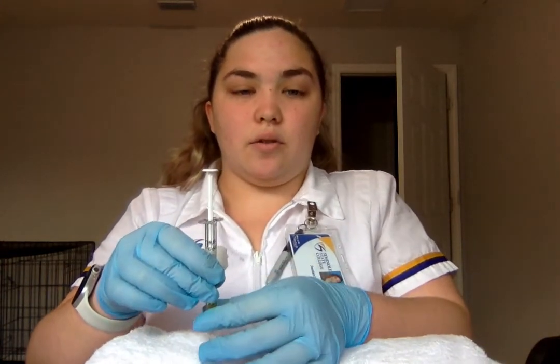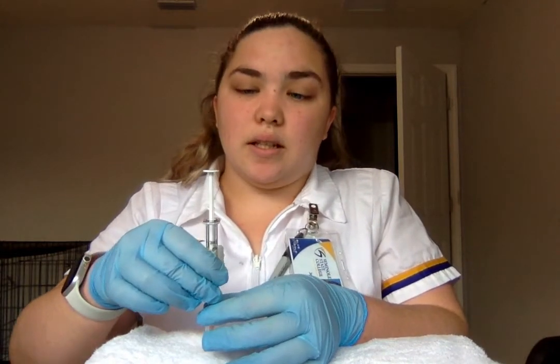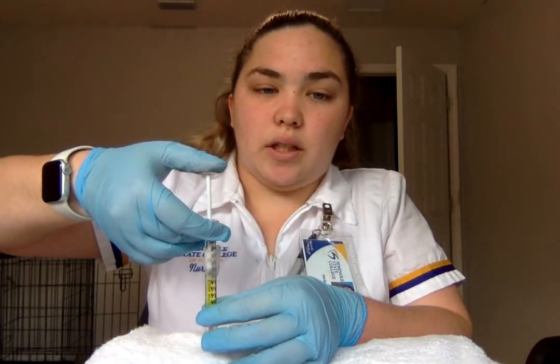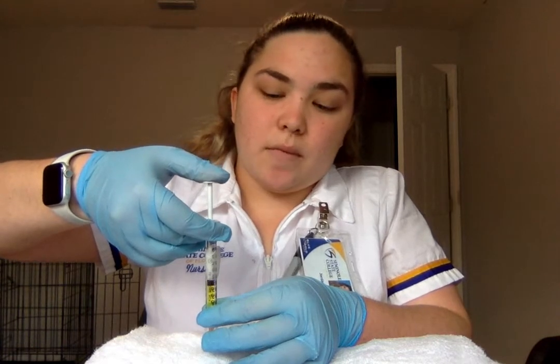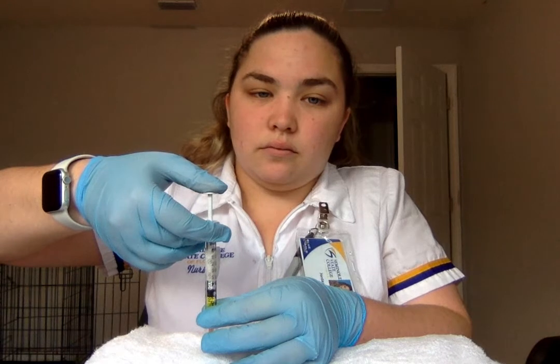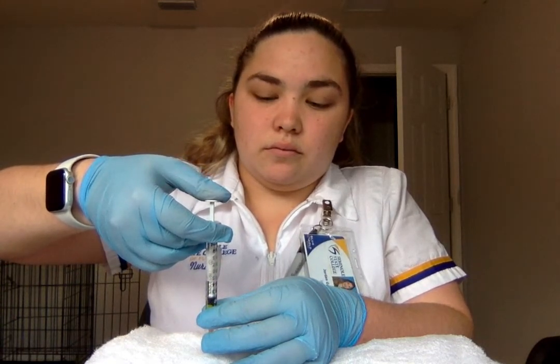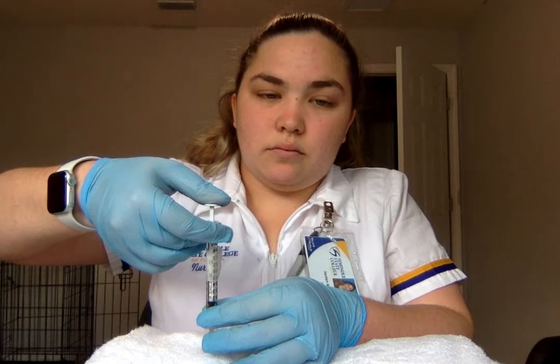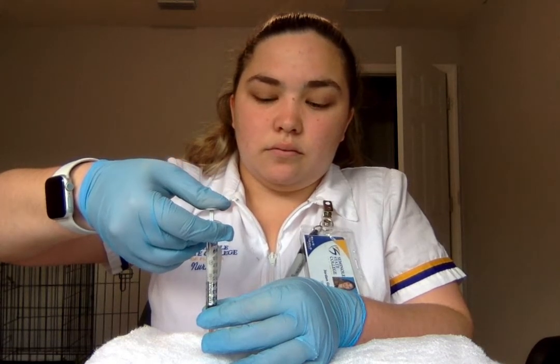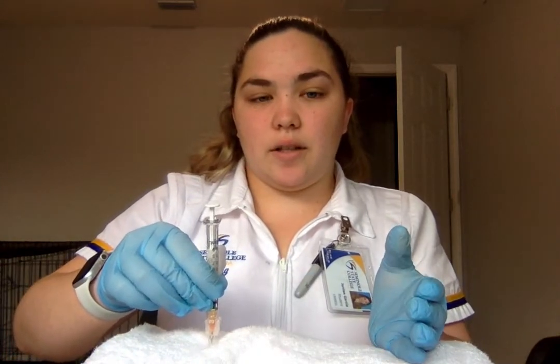And then I'm going to hold it steady, release the skin, hold it steady, and push down slowly again. Okay, now that I've injected, I'm going to pull out quickly.